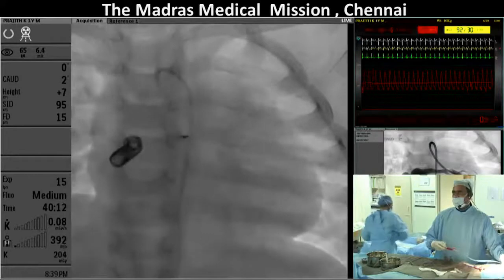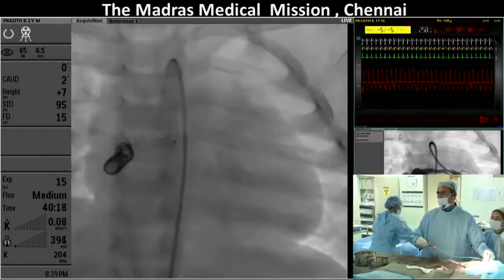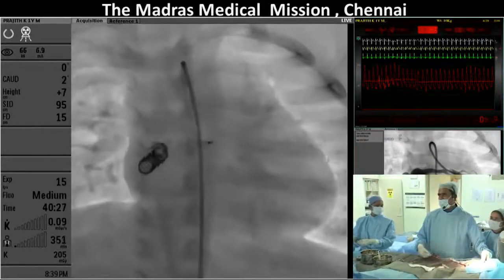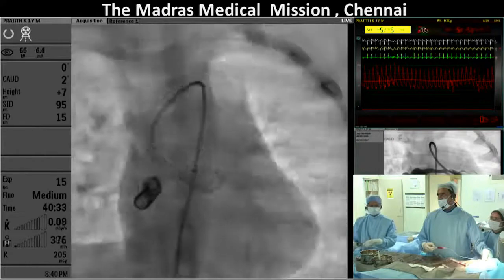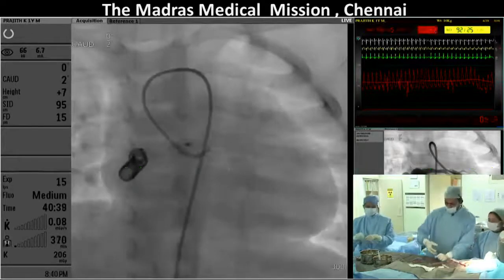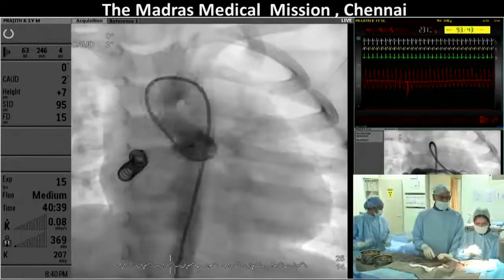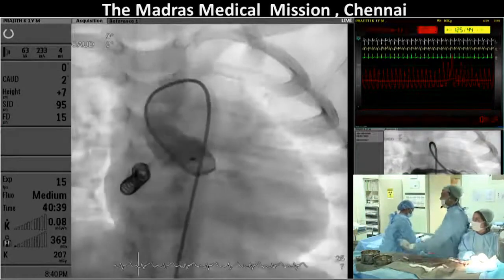It's a bigger curve. Whilst they're doing that, any other questions or comments? That one's too big a curve, isn't it? Yeah, unfortunately, in India, getting a 2.5 is very difficult. Even if you plan, so many times you end up shaping them in. It'd be nice to get a really good angiogram. I'll definitely give it a try. I will get an EBU 5.